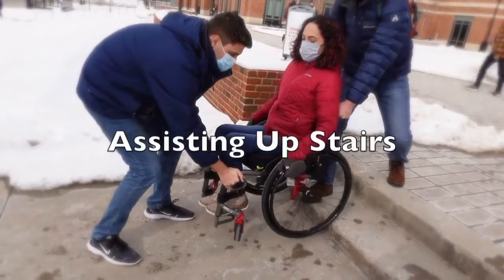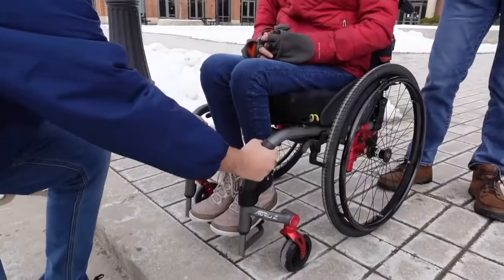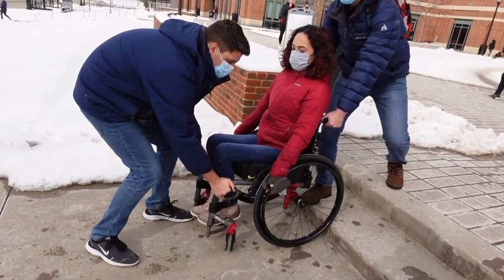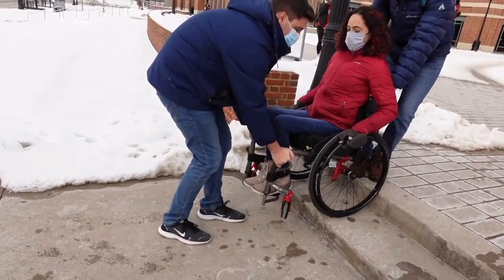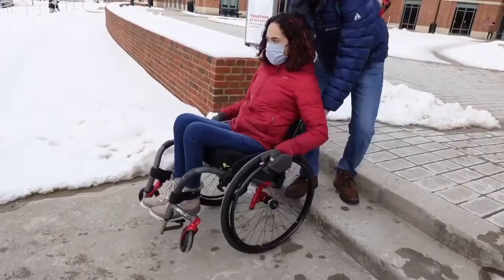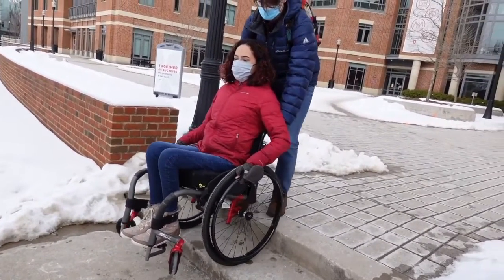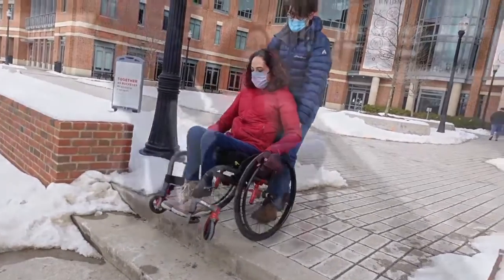There are a few ways to help a wheelchair user upstairs, but these are the safest methods if they would like to stay in their chair. You will grab the chair from the same spots as if you were to pick up the chair, but you will not lift the chair off the ground. Instead, you will push and pull over the stairs as if you were driving your car over a speed bump. It is still doable with one person, however, the wheelchair user will need to be able to keep a wheelie, so be mindful of their balance while going up the stairs.